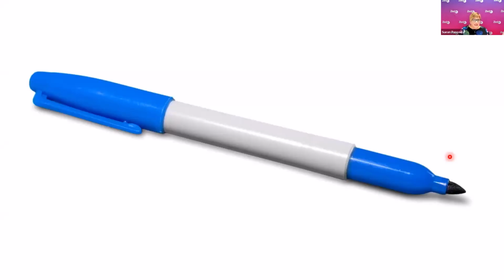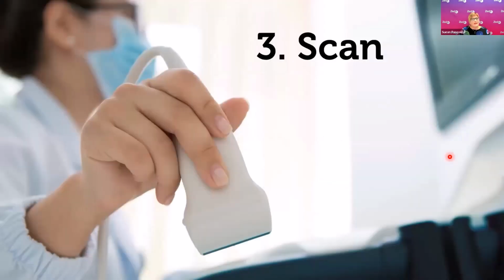The other thing to have standing by is a permanent marker pen. Because at the end, when you've found your foreign body, you need to mark on the skin where it is so that you can go about retrieving that foreign body. Now that leads us on to how we go about scanning for foreign bodies.